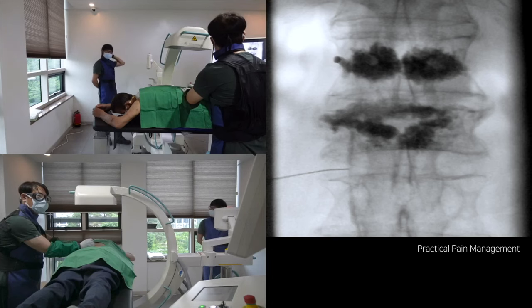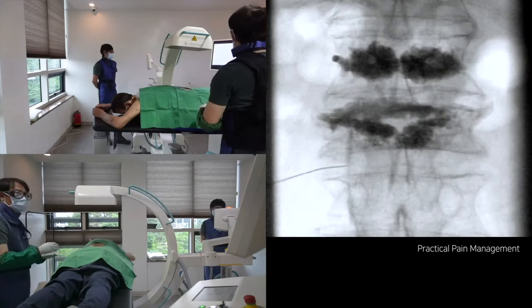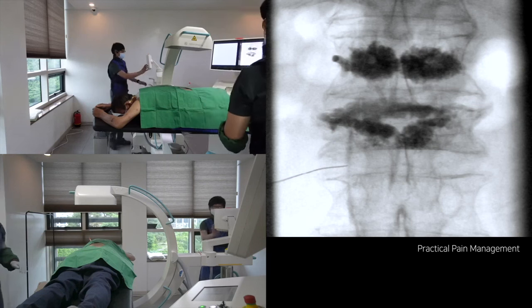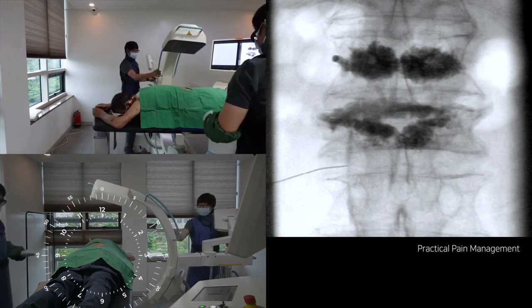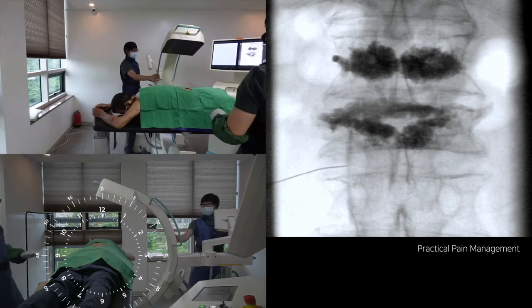The lamina is narrower than the lower lumbar region in the upper lumbar region. Do not try to go medial to the lamina. Instead, it should stay outside the connecting line along the medial border of the pedicle.